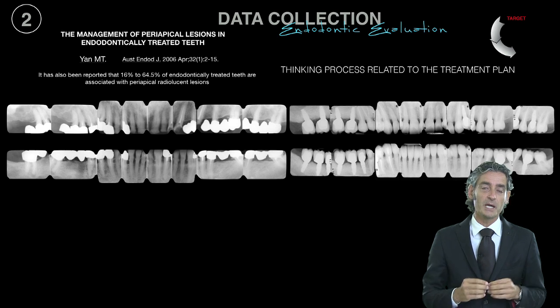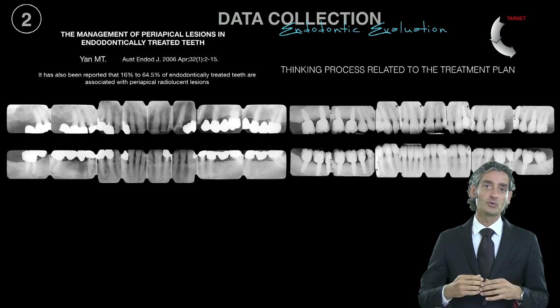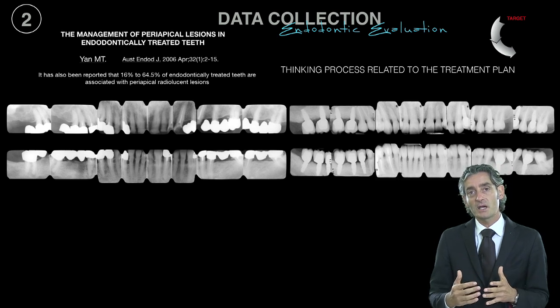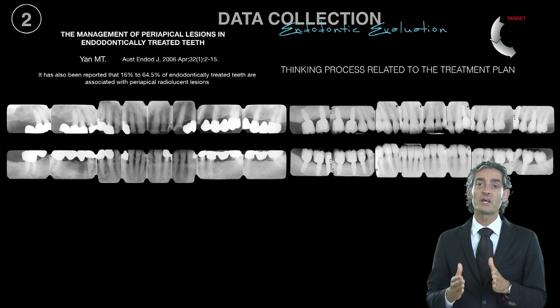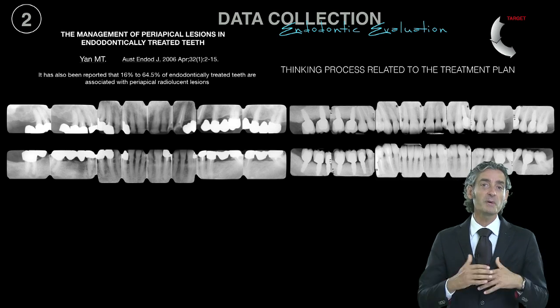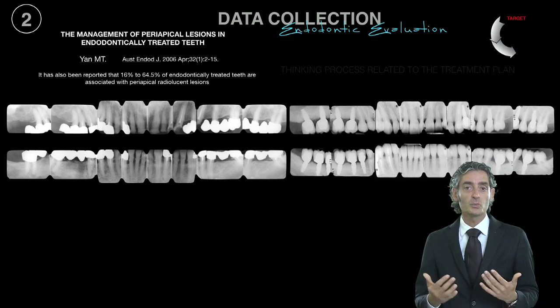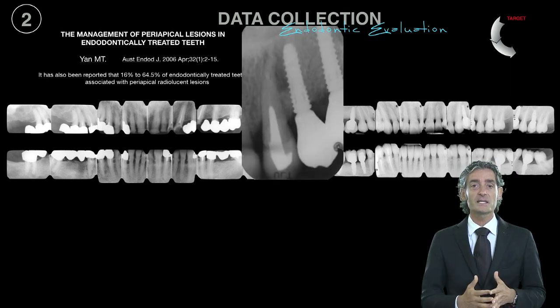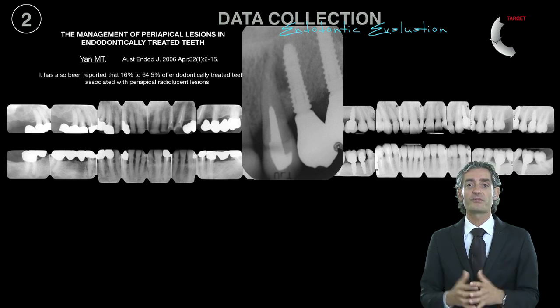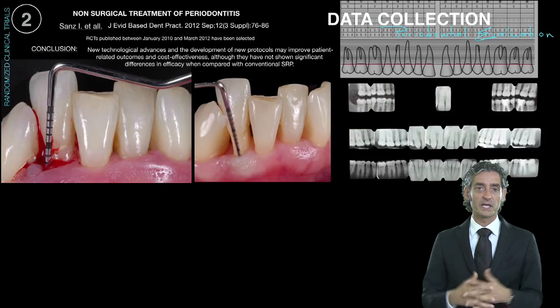But every single time we are going to get back into the endodontic space to create a post or something like this, as advice, I would say that it's better to go for a retreatment of the tooth, to be sure that we eliminate all the bacteria that can create some trouble. And if we don't, what we can have is trouble like this, where a periapical reaction is contaminating in some way the surface of our implant after a while. And so this is a problem that we can have.